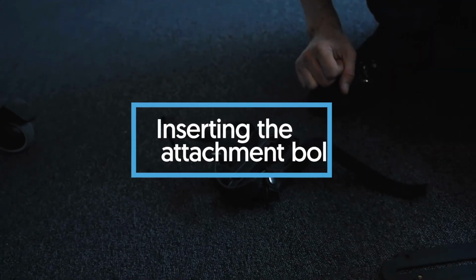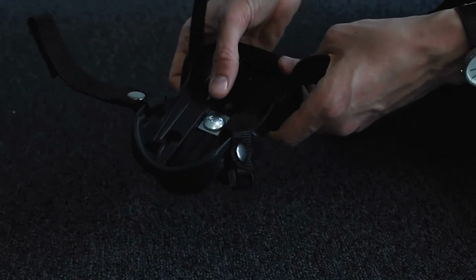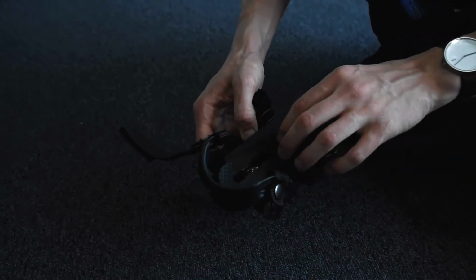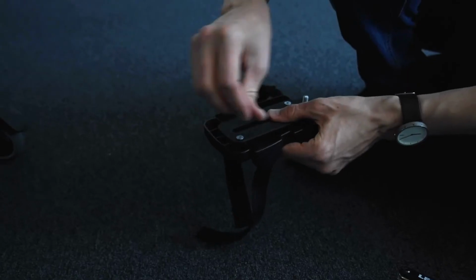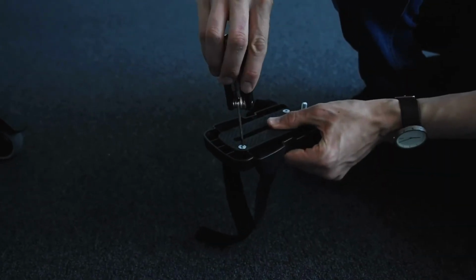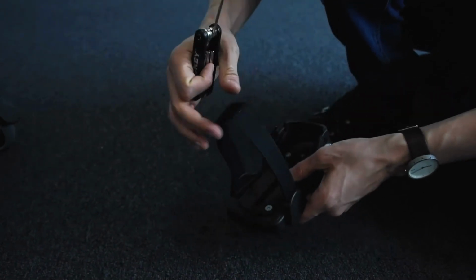Inserting attachment bolt. Insert the required attachment bolt along with the retention plate. Place a rubber lid on both the top and bottom of the sandal. Fasten using the 4 screws provided. To remove or replace the attachment bolt, reverse this process.